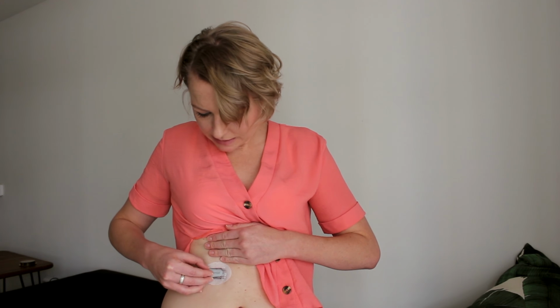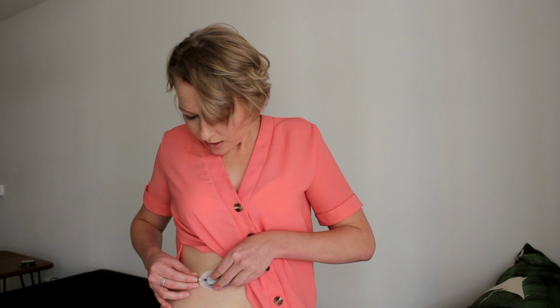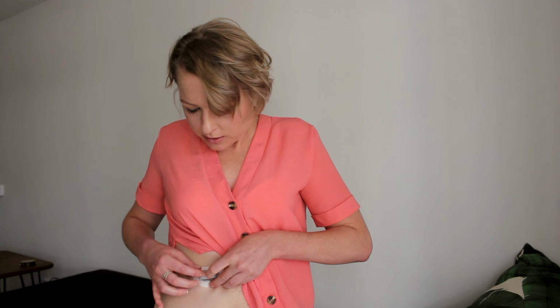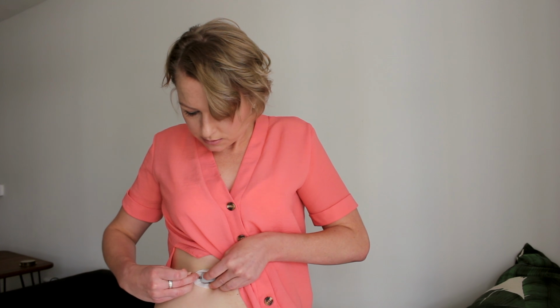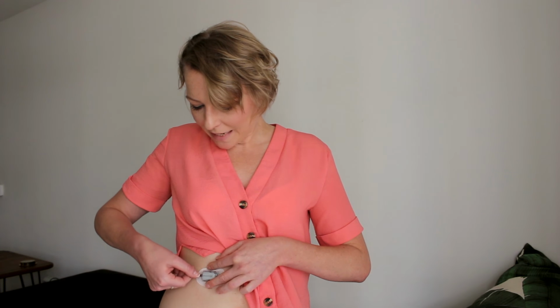Okay, I can't exactly see how that's gonna completely fit in there, but I'm just gonna follow the guide and hold this down, pinch a bit of skin, hold the transmitter down and push this forward. Yeah! Was not expecting that to work. Okay, great. Okay, phew, we're in, we're on, we're good. Final step, twist off the latch.